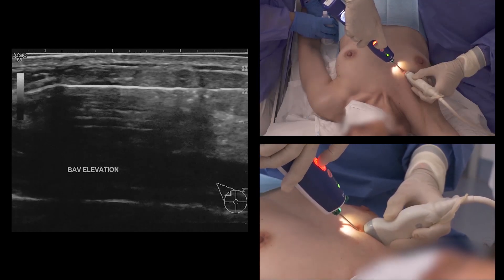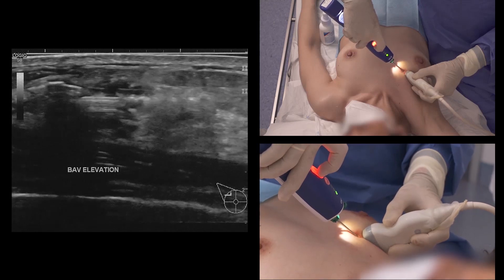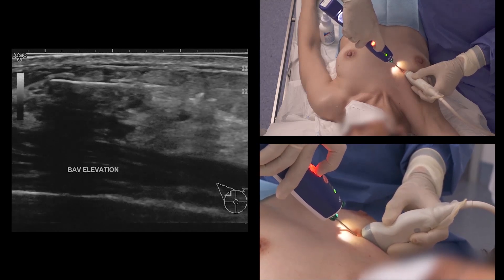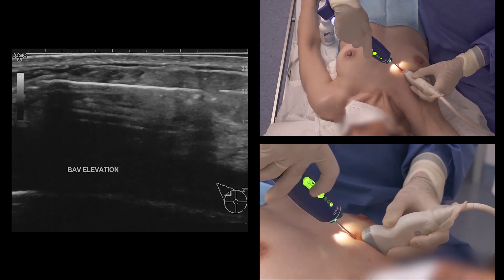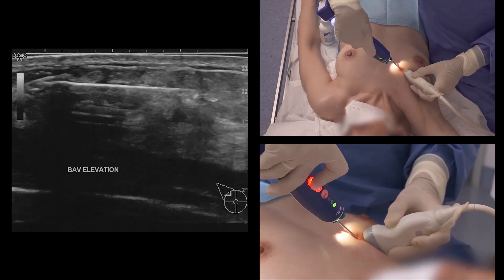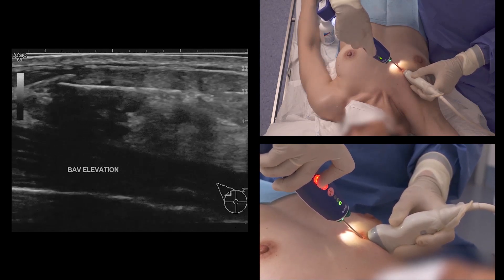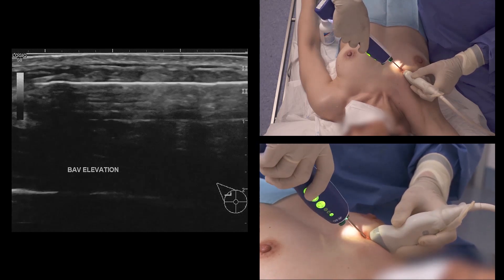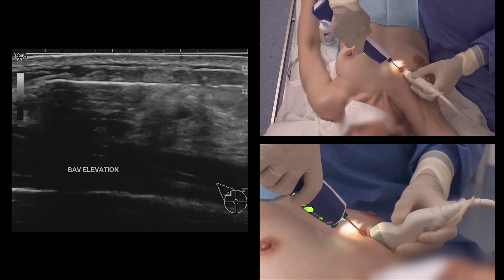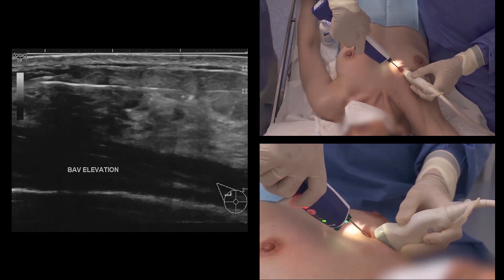Press and release the sampling button to collect samples, which are driven to the sample container at the rear of the driver. Simply rotate the driver to orientate the notch towards the desired location and press the sampling button as many times as needed. Multiple samples are obtained with one needle insertion.